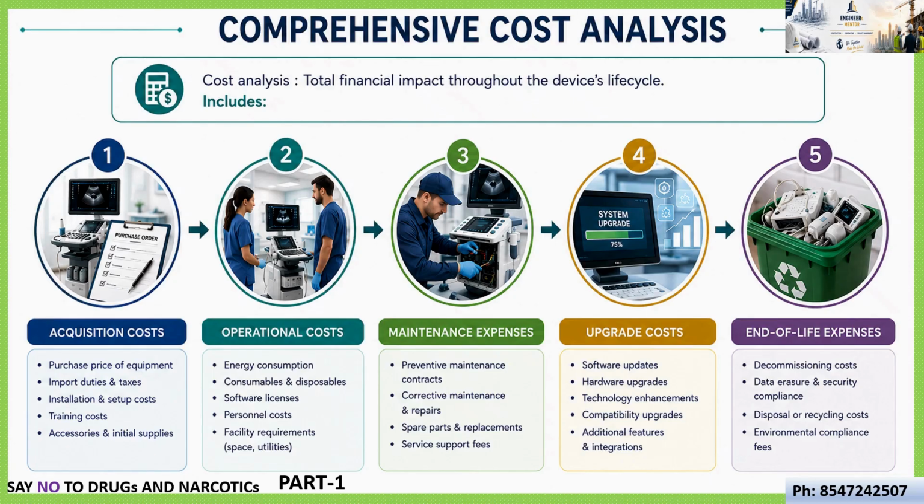Whereas, for example, if we purchase a CT scan, it is not for 1 or 2 years. You have to see that it is for 20 years, 30 years in future, because after 30 years, we don't know what upgrade is going to happen. So we have to see the upgrading cost of that CT scan after 20 years or 25 years. So that cost also is a part of cost analysis.